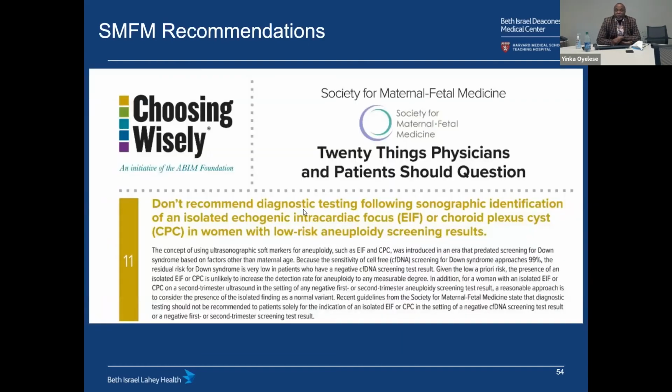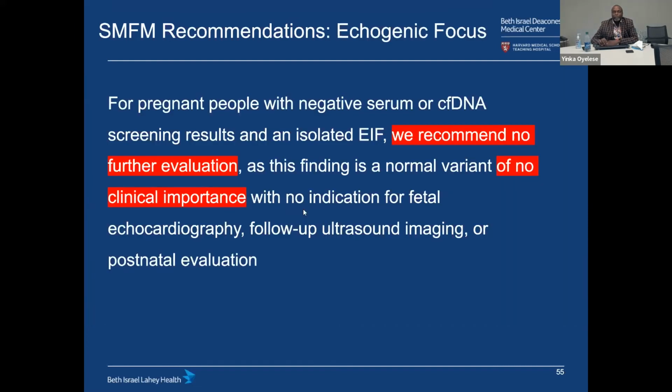And indeed, the Society for Maternal Fetal Medicine partnered with Choosing Wisely and said 20 things physicians and patients should question. And here, number 11 is do not recommend diagnostic testing following sonographic identification of an isolated intracardiac echogenic focus or choroid plexus cyst in women with low-risk aneuploidy screening results.